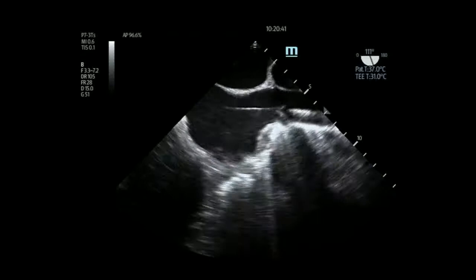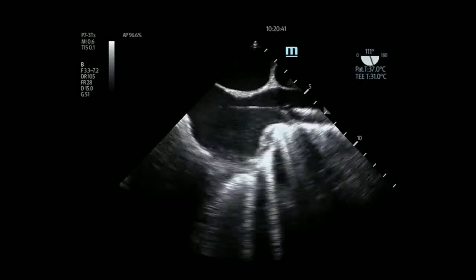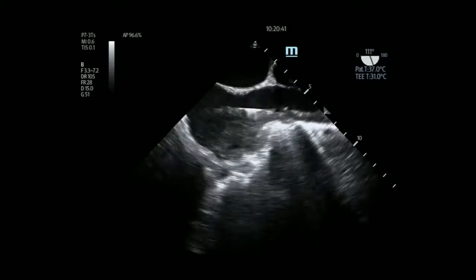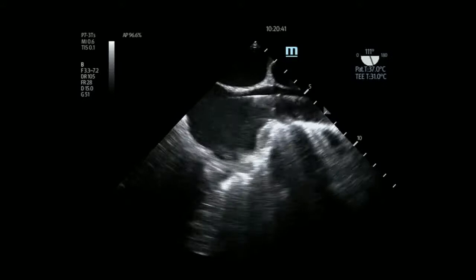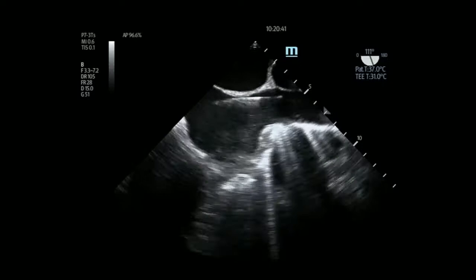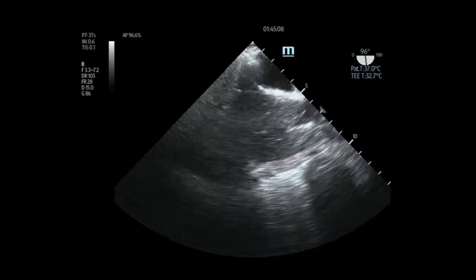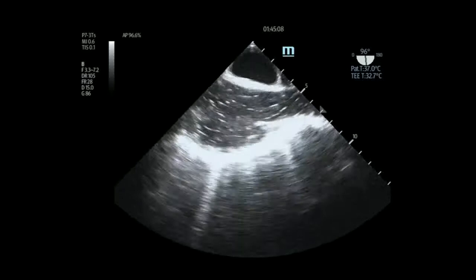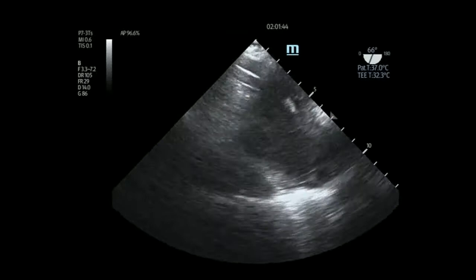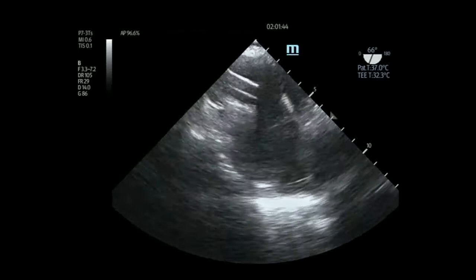The last view is the bicaval view. This just shows someone putting in an IJ while we're doing TEE, and it's so obvious where the wire is coming down—the SVC is there, and the wire is coming down it. You can basically make sure all your central lines are always in the right place, because you'll see the wire come through that area every time. This is especially helpful when putting someone on ECMO in cardiac arrest—you can see the end of the ECMO catheter right there in the right atrium, exactly where you want it.